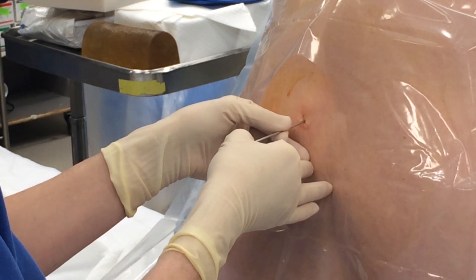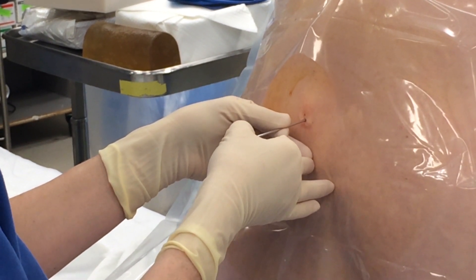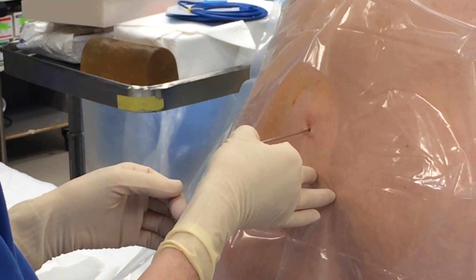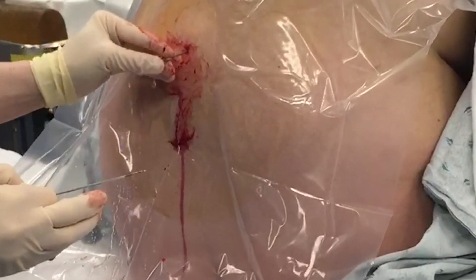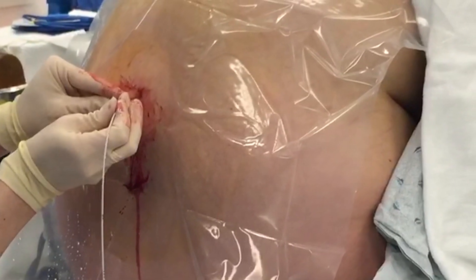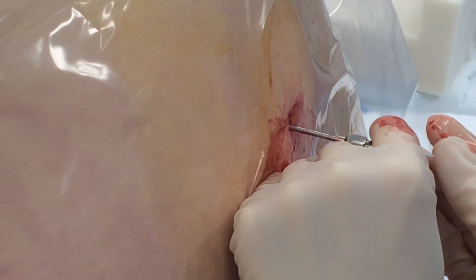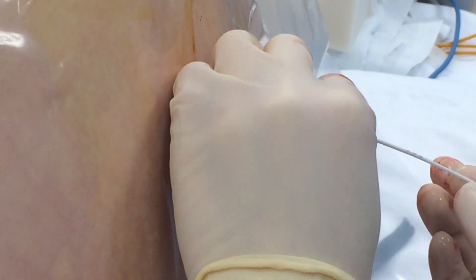Perhaps one level up would be appropriate, but probably not more than that. The needle is simply advanced blindly until it appears to be in the space, and then the stylet is withdrawn. If you're properly in the subarachnoid space, simply have your assistant hand you the end of the catheter and begin to thread. The flow of CSF through a needle this big is going to be really brisk — it's not subtle.